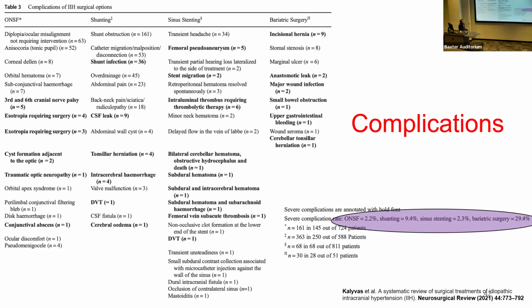Venous stenting, you got basically a stick on the groin or the arm, 2 sticks, one for the artery, one for the vein, and recovery is really fast. You go home usually the next day. Obviously, any procedure has benefits and risks. But in this case, the risks are around 2 to 3%.